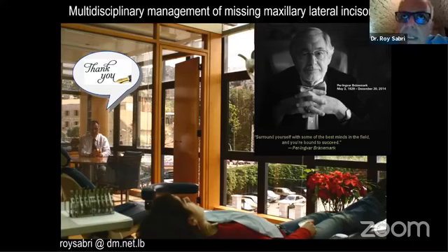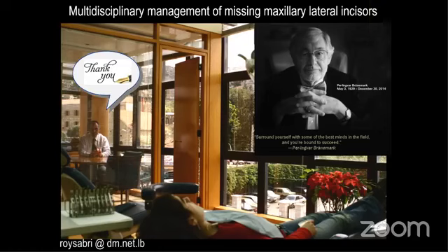And I started with expansion, knowing that I might not get a lot of expansion. But as you know, in adults, if you don't open the suture, you can still get some bending of the alveolar ridge. So I was hoping to get the best I can, but I got more, maybe because of the cleft. But I used the regular Haas appliance, tissue-borne Haas with a jack screw.